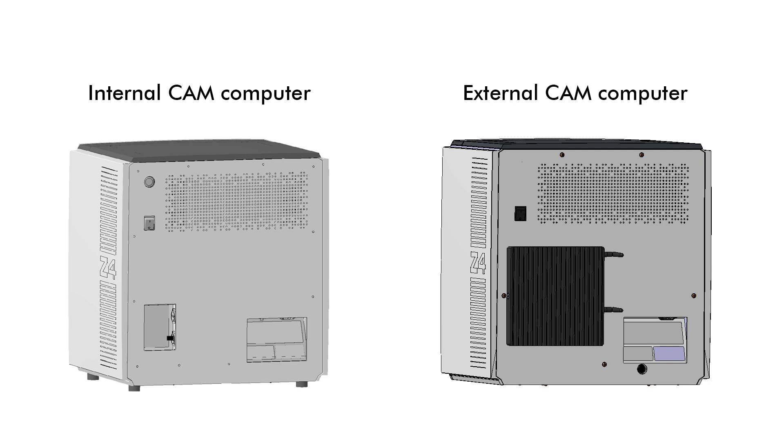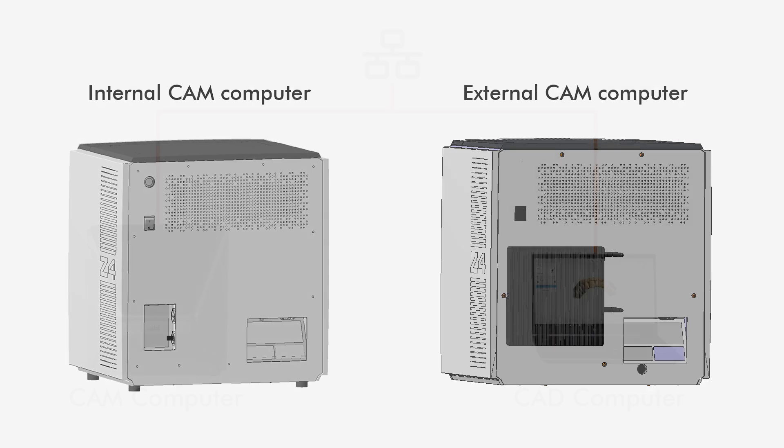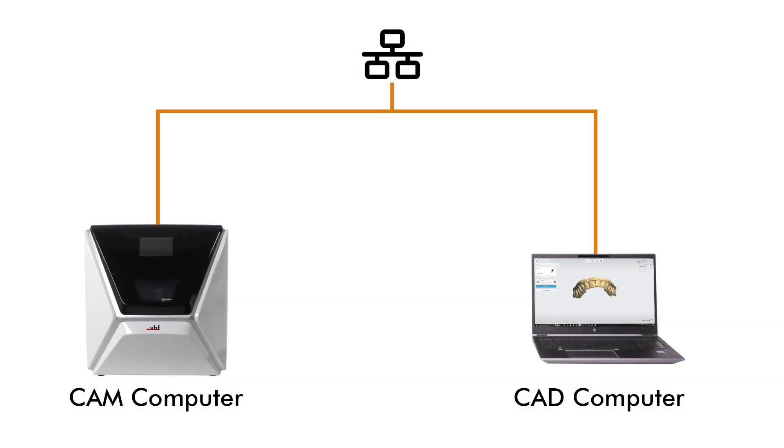Refer to the operating instructions for more information. Make sure that the CAM computer and CAD computer are connected to the same network. The standard way to operate the CAM computer is using a remote desktop connection on the CAD computer.